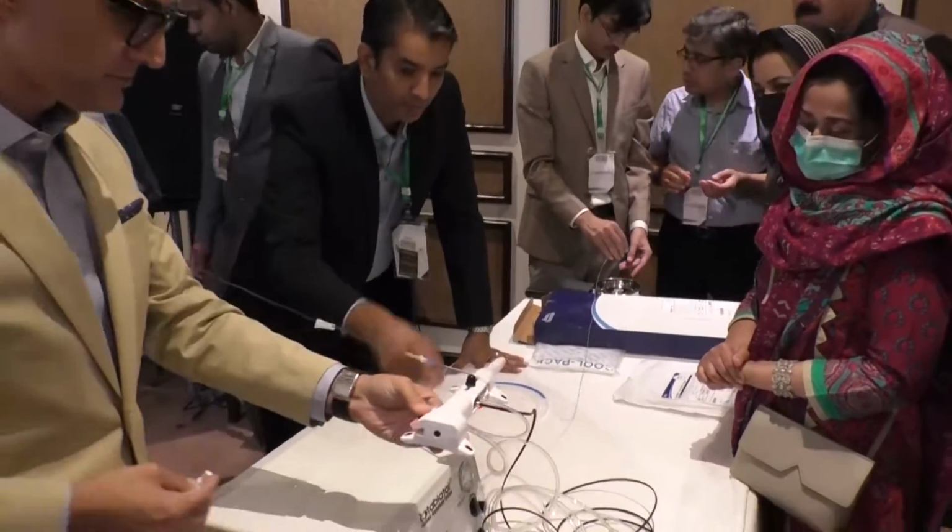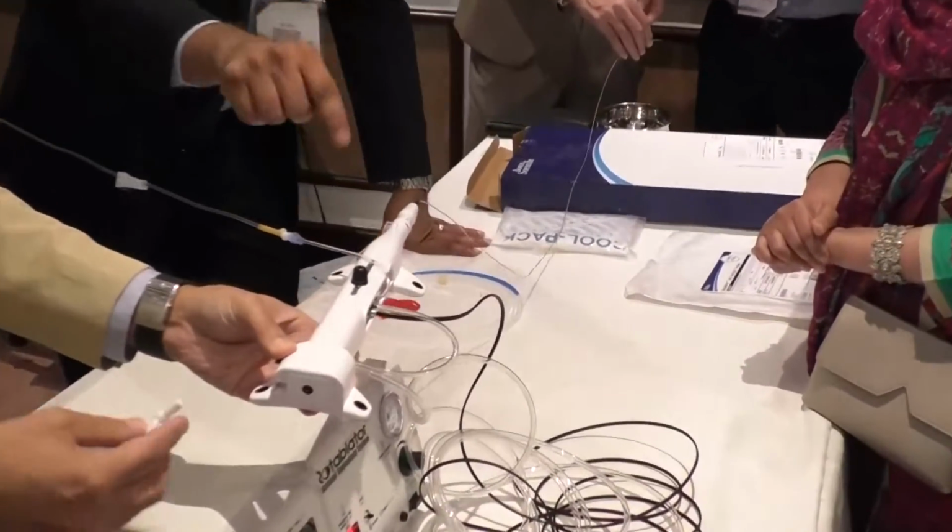Dripping from here, it's very important. Somebody said that no, it's not normal. It's a normal thing. It should happen here as well.